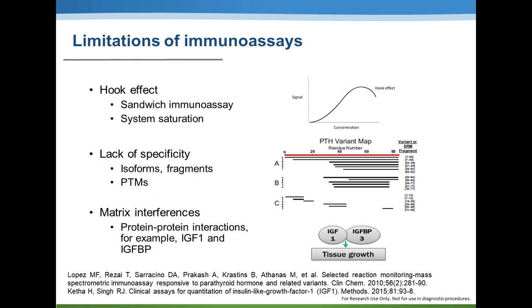Hook effect, which is only applicable to the sandwich immunoassays. As the concentration of the analyte increases above a certain point, the system gets saturated and the signal begins to decline.